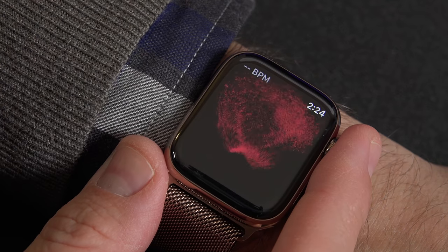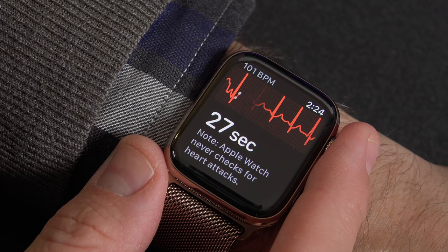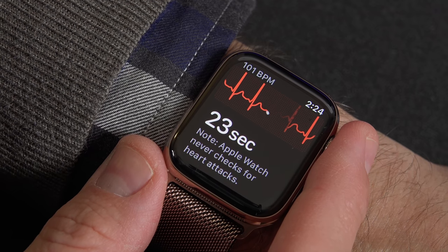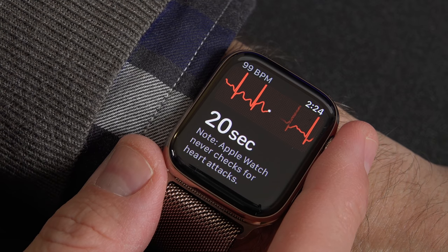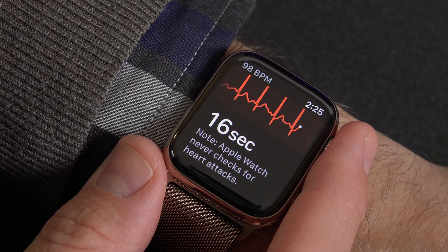What's up guys, Mike here, the Detroit Borg, with a quick video taking a look at a feature I couldn't demonstrate with the Series 4 Apple Watch when it first launched. Watch OS 5.1.2 finally brings us the EKG feature, which allows the new hardware on the Series 4 Apple Watch to measure your electrical heart signals.